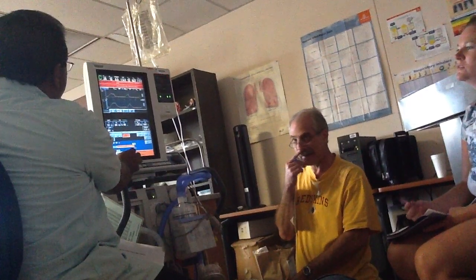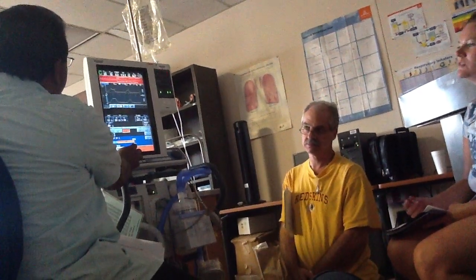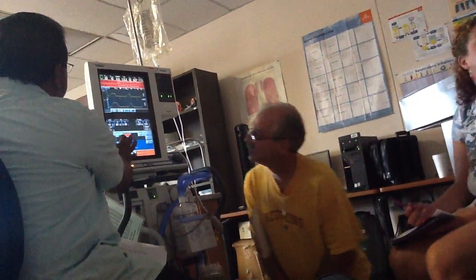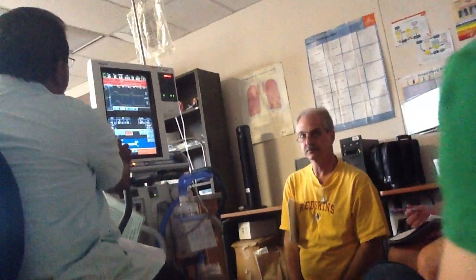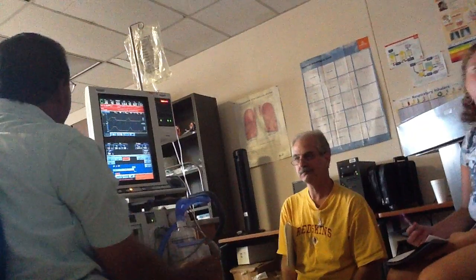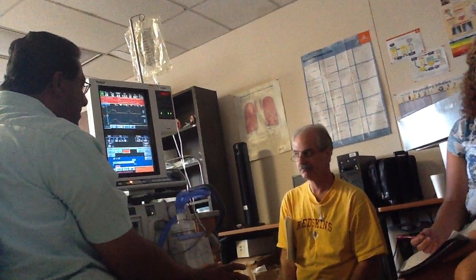Okay. Now your IE is unlocked. Your TI is unlocked. Now your IE. So basically you can only lock your IE ratio on this machine.